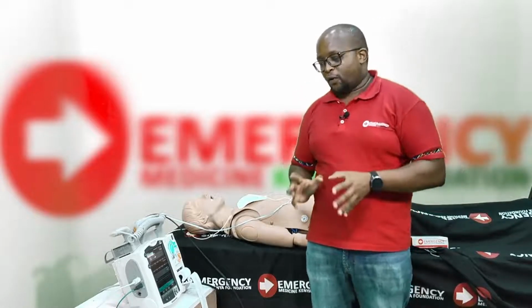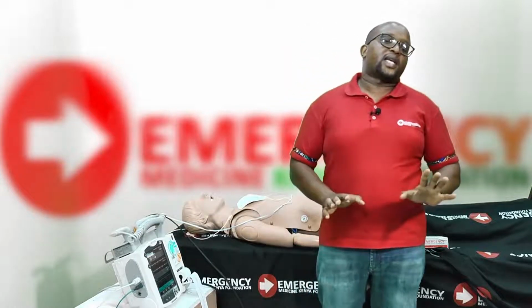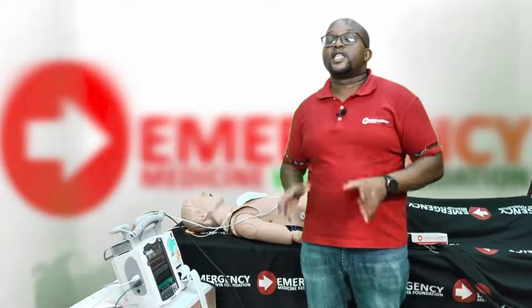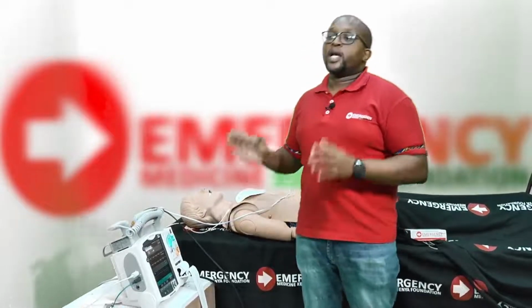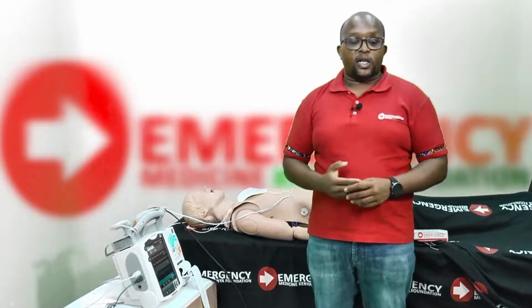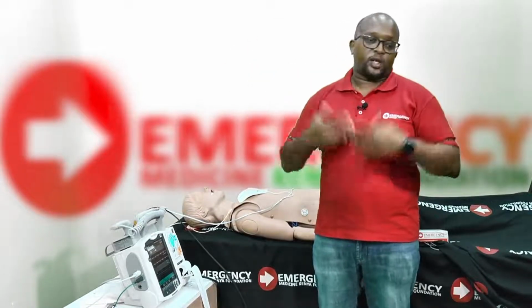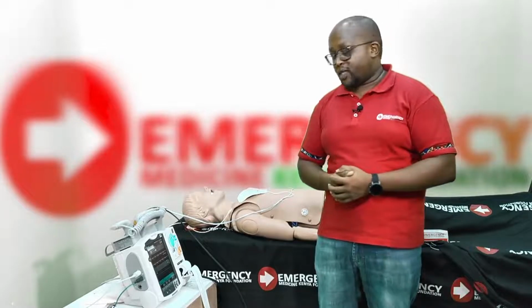Like I said before, once we start pacing in an emergency care setting, you do not stop pacing. You don't want any situation where the machine will stop pacing the patient, because essentially when that happens, the patient will go back to where they initially were, and sometimes they'll go even further down into hypotension and may end up even in an arrest situation.